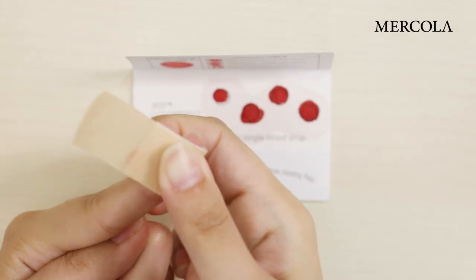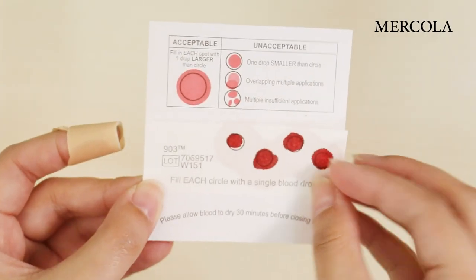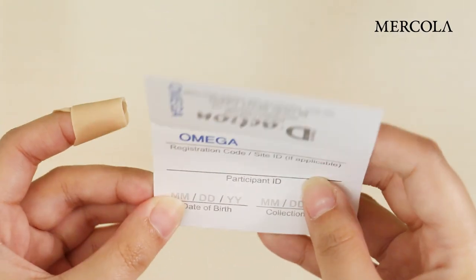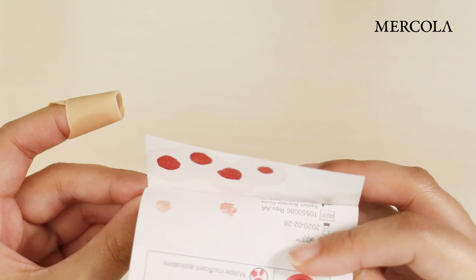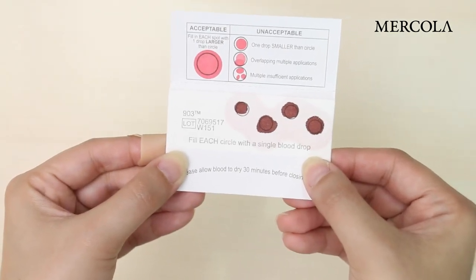Then apply the bandage to keep the blood from flowing. Now that you've done this, check the back side of the card to make sure that the blood has fully soaked through. Set the blood spot card aside for 30 minutes to dry.